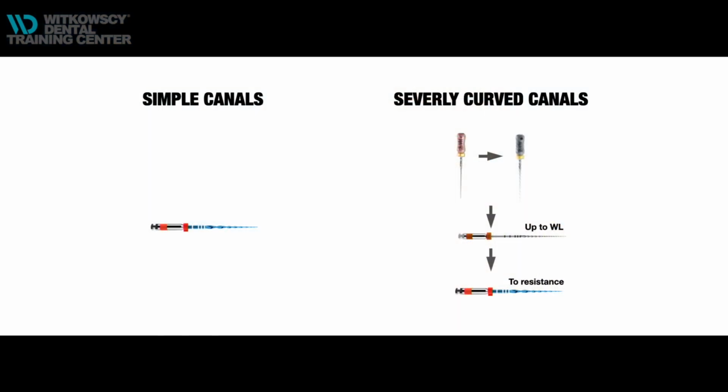Well, in most of the cases you can prep with one file if you use the system like I did in this situation. I was using the Reciproc files here, and I was not doing any glide path and no scouting. And the biggest problem is not forgetting about scouting, but that I misjudged the anatomy. And of course, you might say, yes, but it can happen. Yes, of course. But if we can avoid it, please do so.